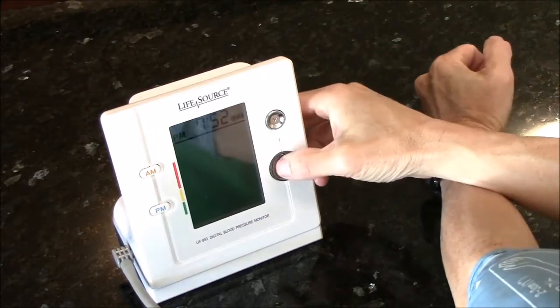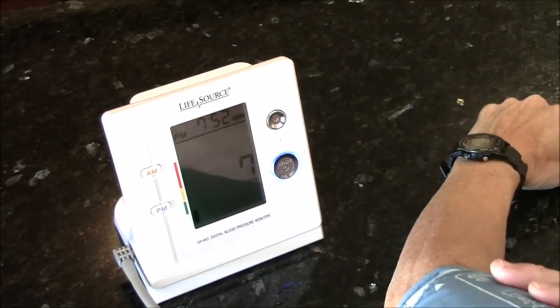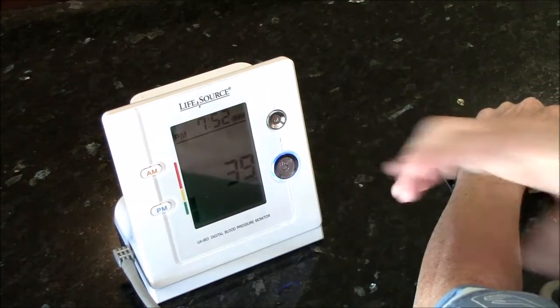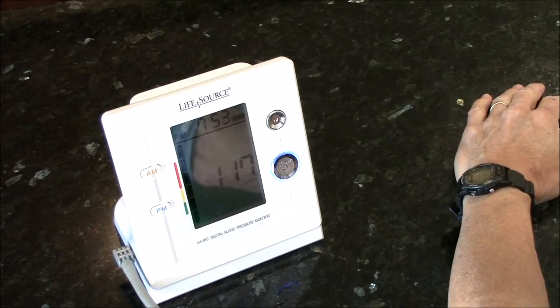Cuff, turn on the machine, the cuff inflates, and this is a measurement of the pressure in the cuff. And it's listening for my heartbeat.